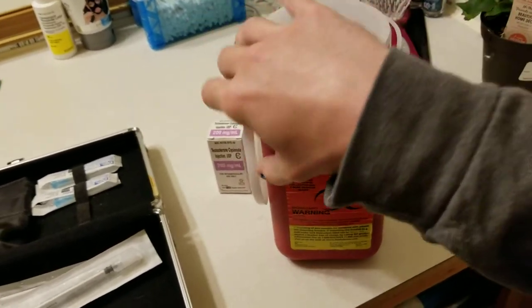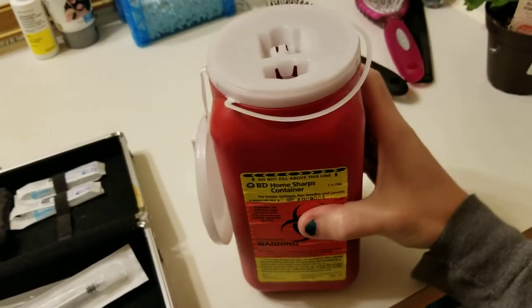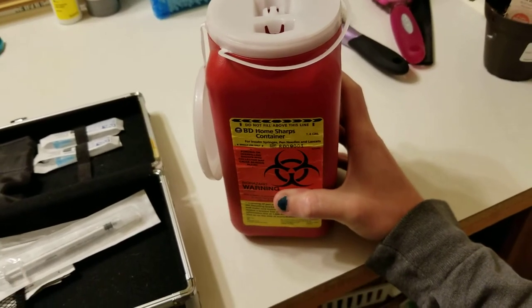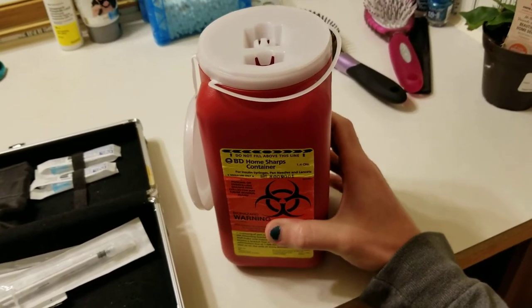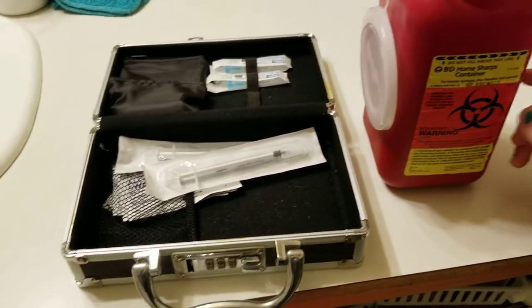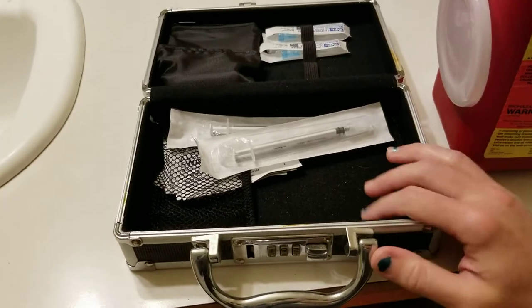When I do my testosterone injection, the empty needles go into this sharps container. Once it's full, the cap gets put on — one that you can't take off — and then you take it somewhere safe to drop it off, usually a clinic, somewhere like that, not literally a hospital, but there are places where you can drop these off.